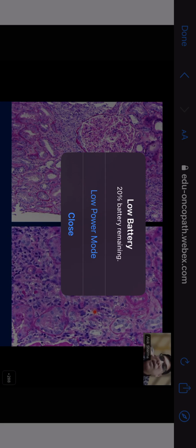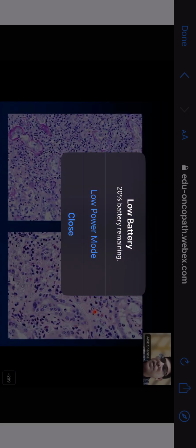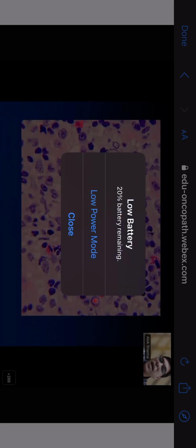But you should remember that in kidney, when you talk about interstitial inflammation and acute interstitial nephritis, the infiltrating cells most of the time are not neutrophils, right? They are lymphocytes and plasma cells, and that is what constitutes acute or active interstitial nephritis. If you have a lot of eosinophils, it will denote an allergic component. That is the only difference from the other. If you look carefully here, you can see a lot of these red colored granules amongst the inflammatory infiltrate. I'll tell you in a moment about acute and chronic, and why I'm not telling you these things upfront. It is good to remember that almost all AINs are predominantly T cell mediated. Most of the immune cells taking part here are T lymphocytes.